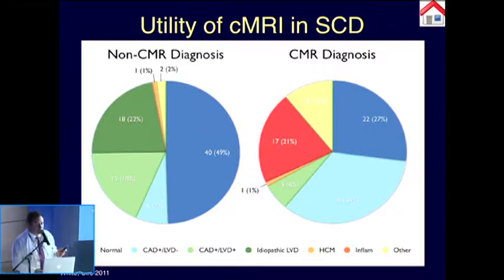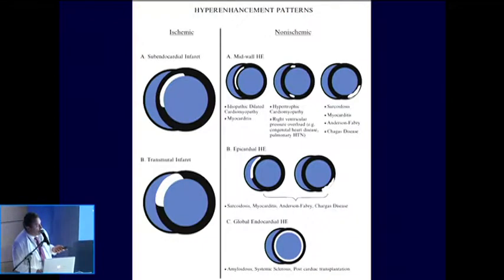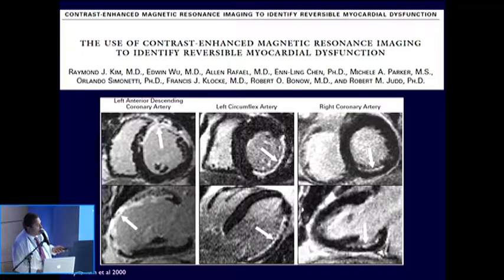Very, very important. One thing is to see the patient with angiography, with nuclear medicine, catheterization, and a completely different thing is to put the patient in the magnet and characterize the myocardium as we can do with late enhancement and the sequences. So this is our pattern. We are going to be looking at it throughout the presentation.